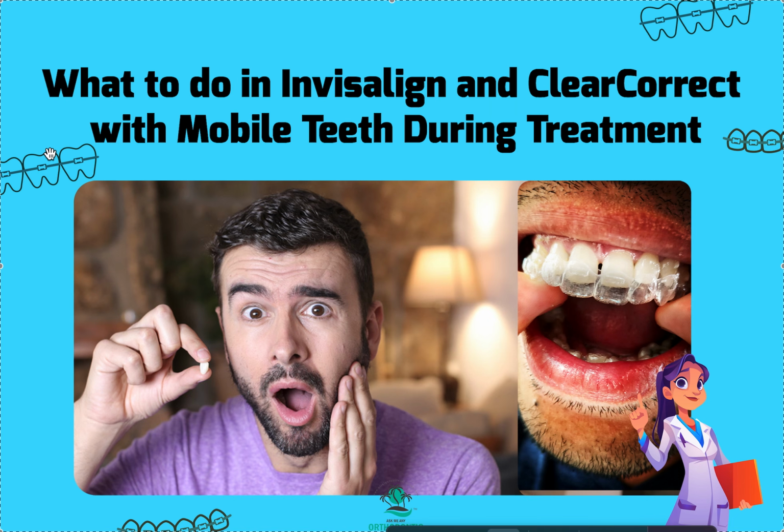So in my treatment plans for perio patients, I put in big bold letters, no round tripping, no proclination, no expansion. What does that mean? Well, that means we're doing a heck ton of IPR or we're taking out a lower incisor. So that's just how it is. But that will help to prevent issues from happening.